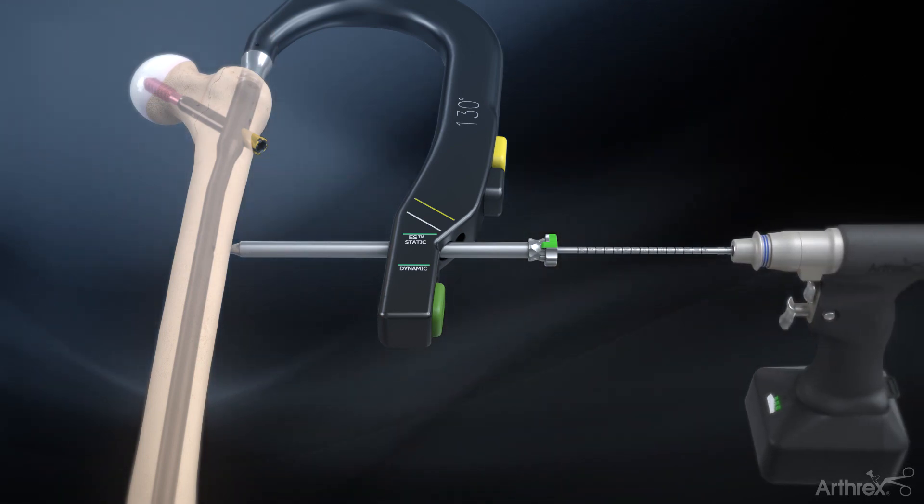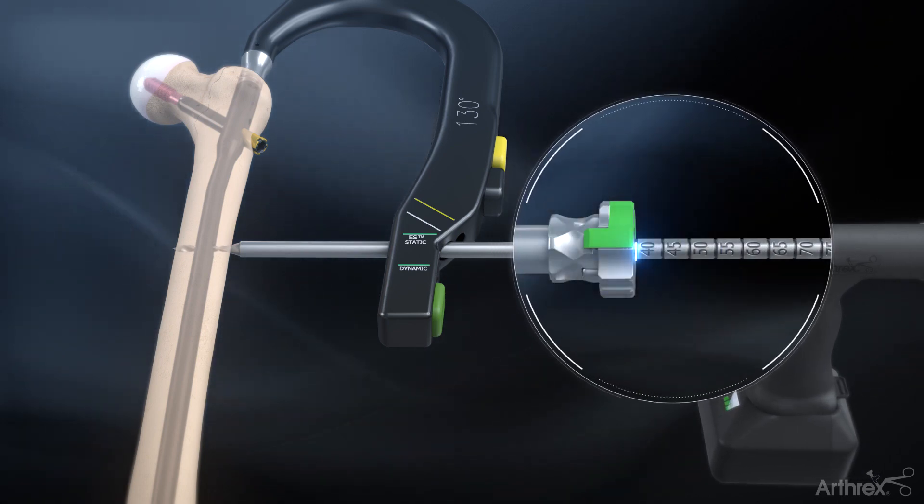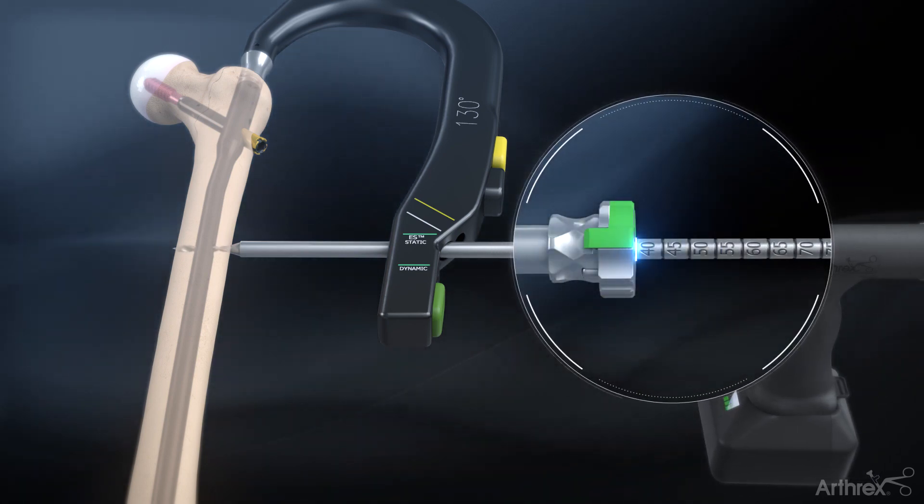Drill bicortically using the 4.0 mm calibrated drill bit. Determine the screw length using the calibrations on the drill bit.